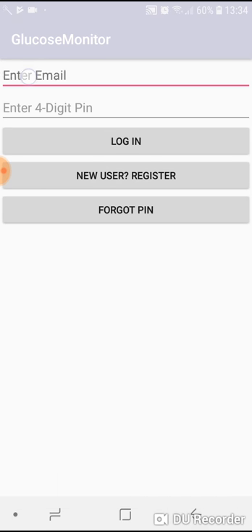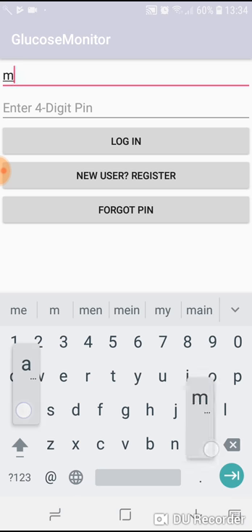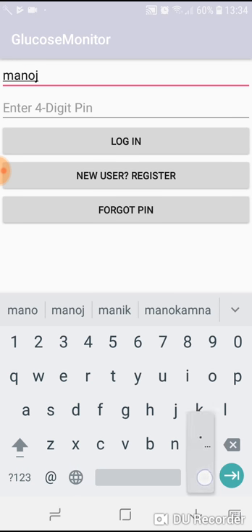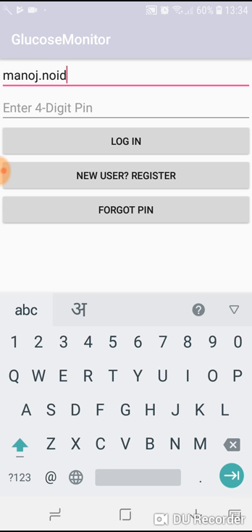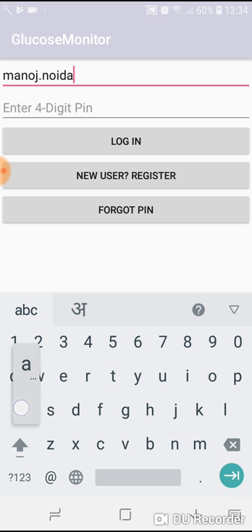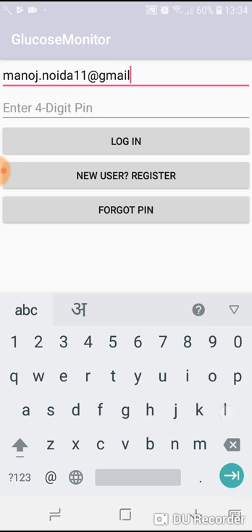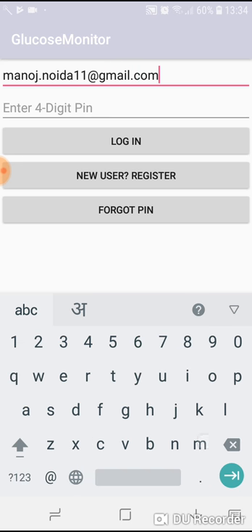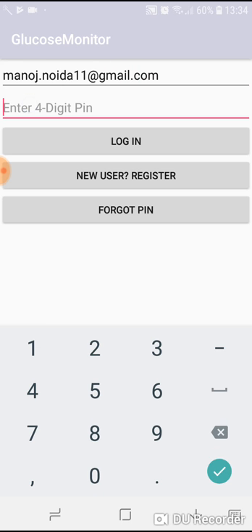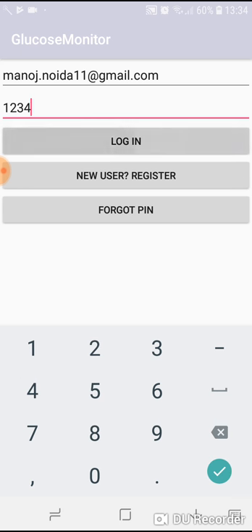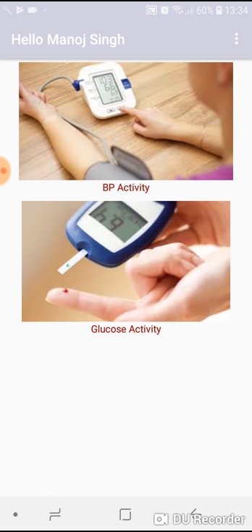I'll press the back button, then I will log in to the application using the credentials that I provided while registering myself. So the mail ID was manoj.noida11@gmail.com and the password was 1234. Login.